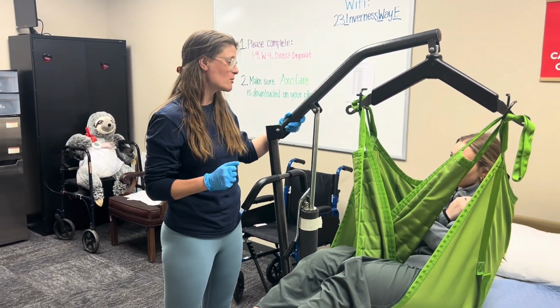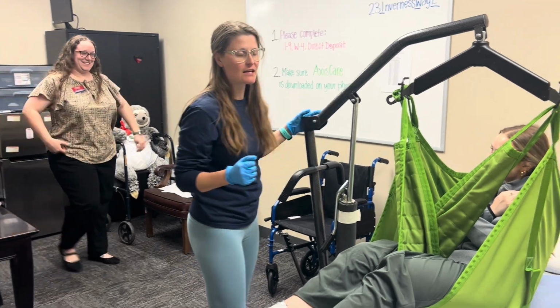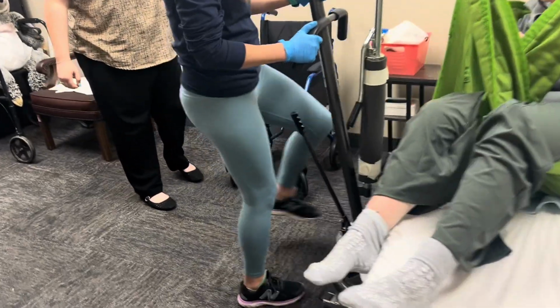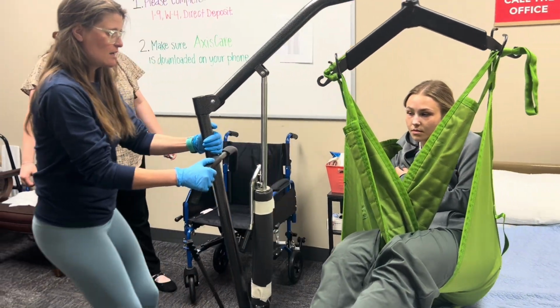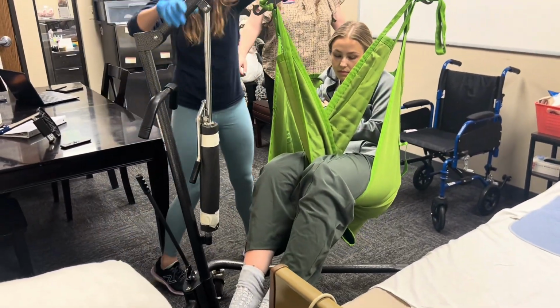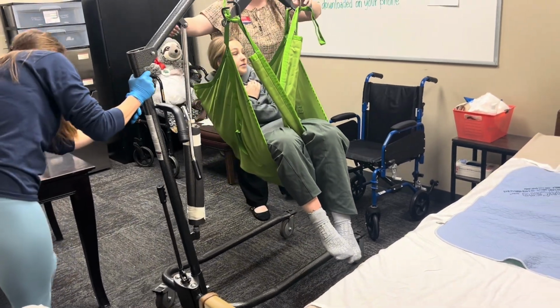So as a caregiver, I'm going to ask for your granddaughter to come join. Having a second person just makes things really safe. A second pair of hands allows the transition to be smooth. So what I'm going to do, Michaela, is pull the Hoyer lift out. The brakes are unlocked, so we're going to slide out. And then we're going to move the device over to the wheelchair. Are you feeling okay? Okay.